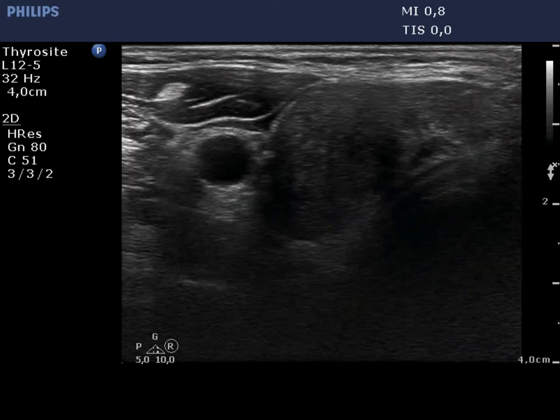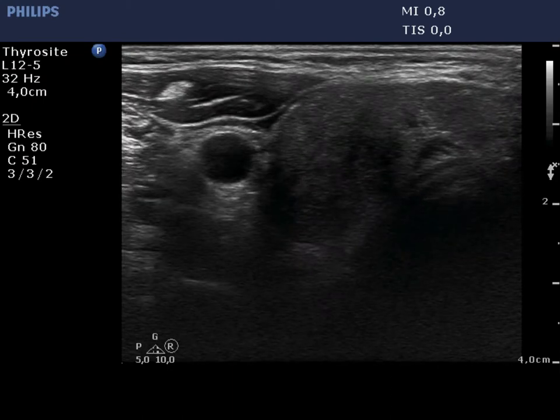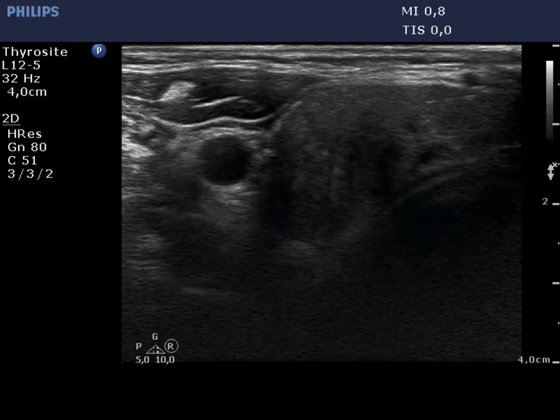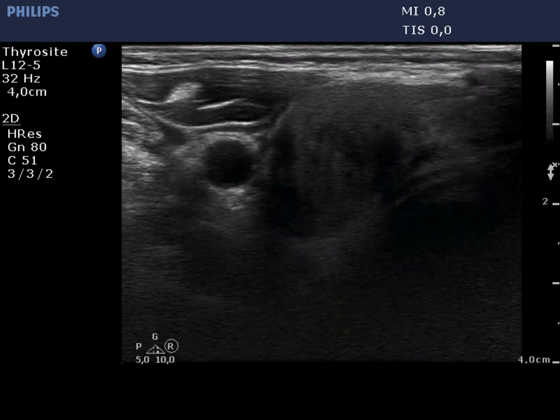Finally, a ultrasound-guided aspiration from a hypoechoic area is shown in the right lobe.